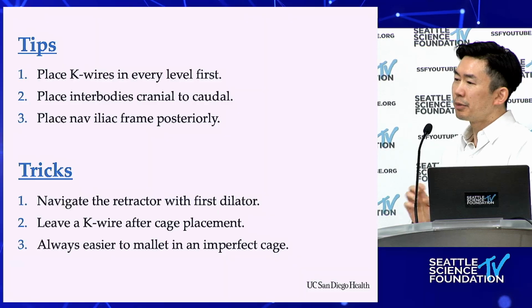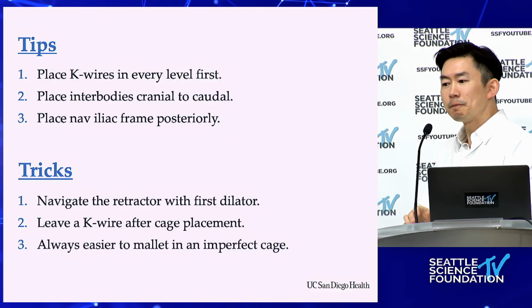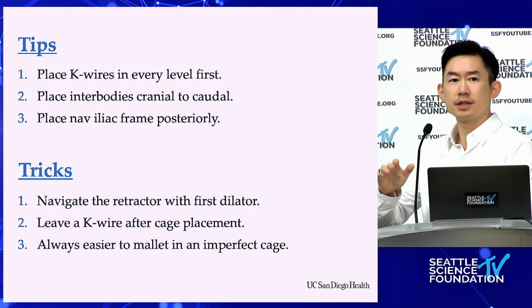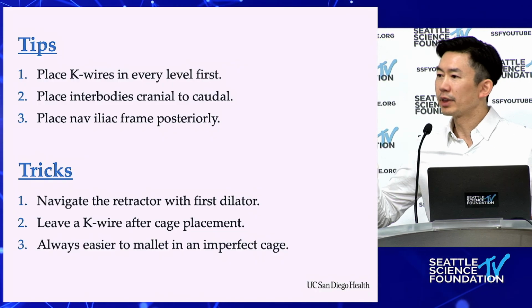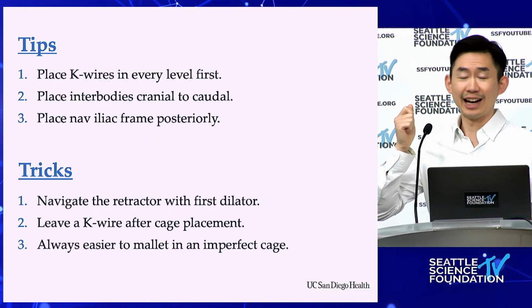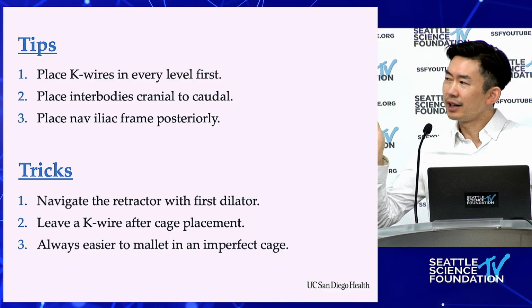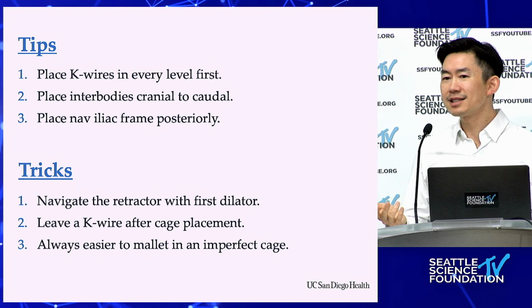Yeah, I think coming from fluoroscopy, my first expectation in using nav was that everything was going to be perfect, right? I'll tell you up front, it's not going to look perfect. I've been using fluoroscopy for a while. Bill said that nav is great, the reps say nav is great, so I think to myself, this better be great. And I use it, and I wanted dead center, and it was forward at the front, closer to the ALL. I'm like, this doesn't look fantastic.